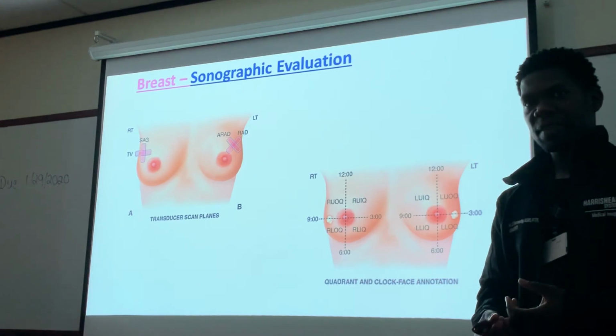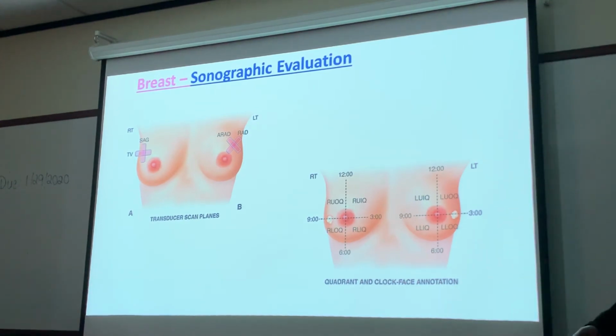We're good, Myra? Okay. So when you're at 1 o'clock, the leading edge, for example with the left breast, doesn't go towards 1 o'clock. The leading edge goes the other way, towards the nipple.